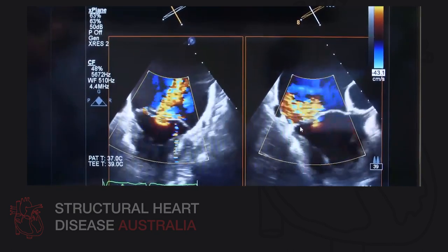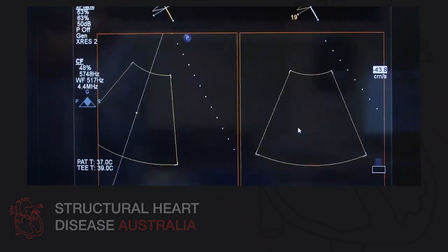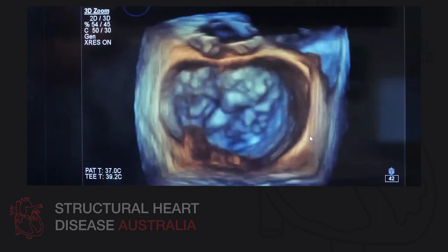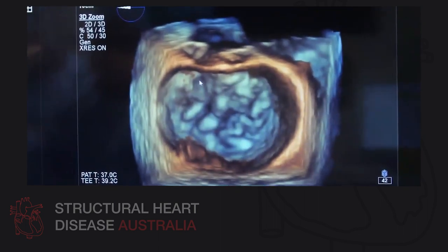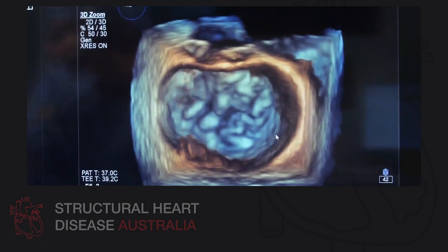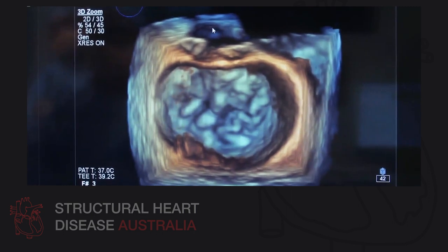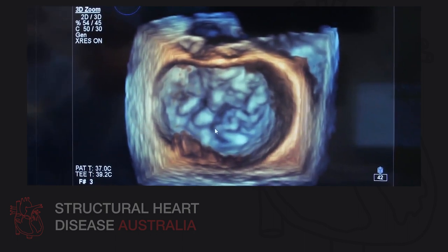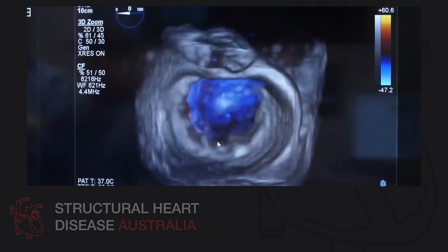The mitral valve leaflets are slightly thickened as well as prolapsing. And we'll just show you when we go to the 3D that this shows that the leaflets are thickened and nodular degenerative change in the valve. It'd be hard to show with my pointer, but this is the anterior leaflet, and this is the posterior leaflet. This is the A2 portion and P2 portion. This is aorta just to orientate you, and this is left atrial appendage. So the jet origin is central, related to A2 and P2. And I'll unfreeze, and you can see that there's perhaps a little coaptation defect there. And in the color image, you can see that the jet origin is central.